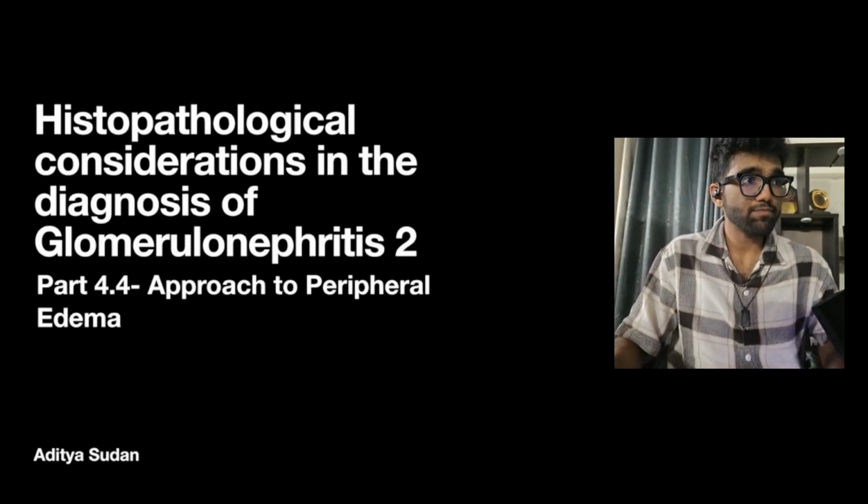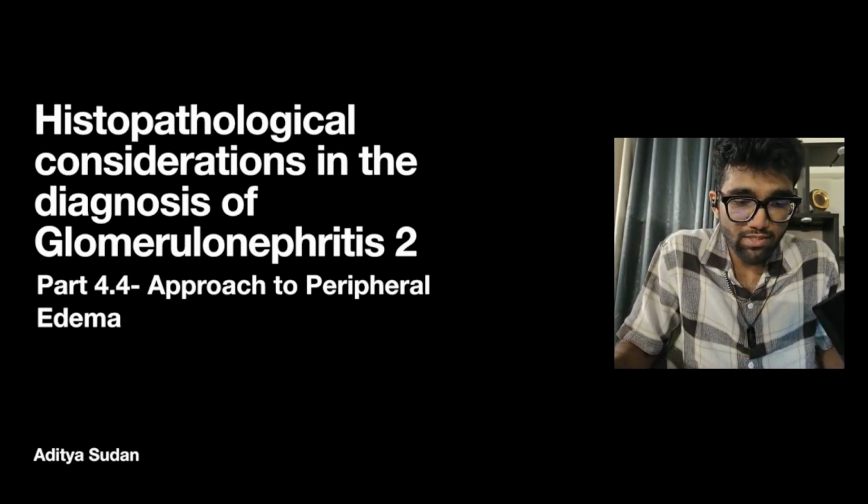Hello and welcome back. Today we'll be discussing the histological considerations in the diagnosis of glomerulonephritis, and this will be the second talk under this heading. And this is part 4.4 of an approach to peripheral edema.